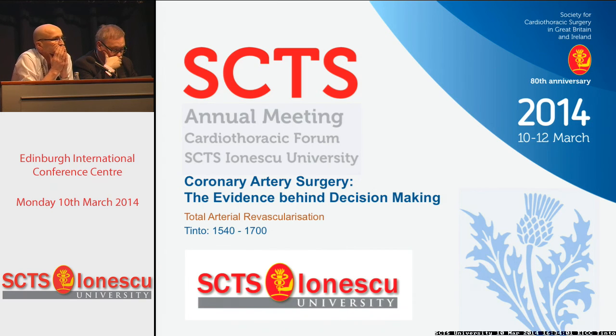It's a very important question in the practice, really. Especially, we brought the issue of off-pump. I myself am a strong believer in the shunt. Intracoronary shunts. Using intracoronary shunts, does it raise inside you any doubt about the anastomosis? Or once you're using the shunt, if you're doing off-pump, you are happy with every anastomosis? I think it's a good point.